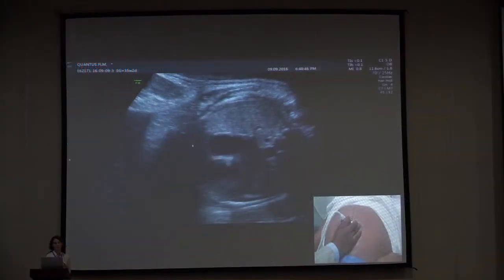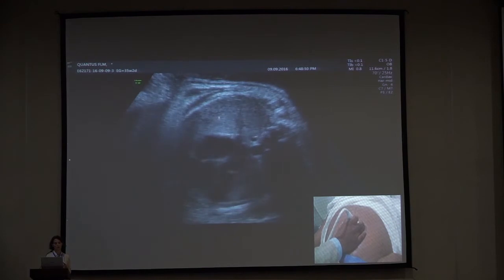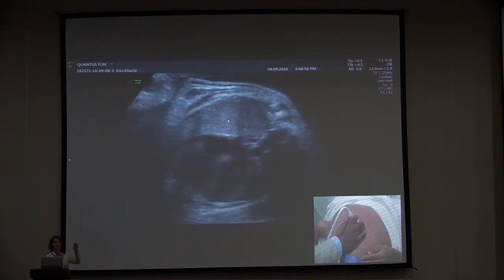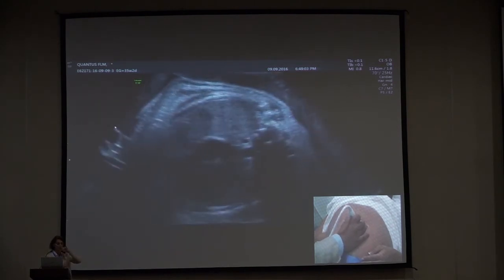Here we can see an example of the optimal acquisition of the required image. As it is shown, the required image is a quite standard view, often used in the obstetrics and fetal medicine field. Once obtained, the image must be saved in a pen drive in DICOM format.